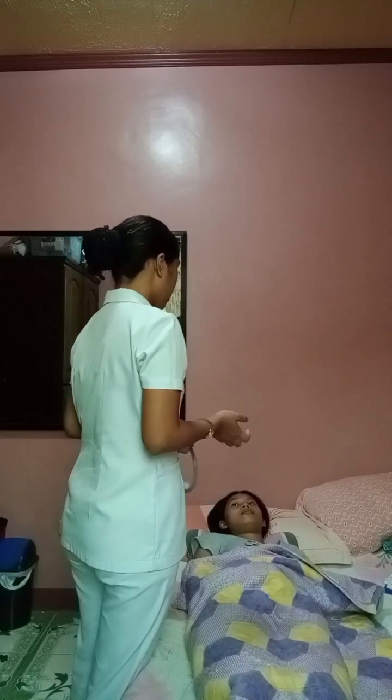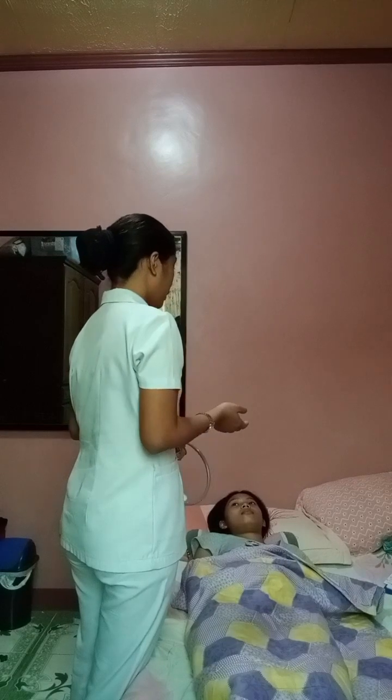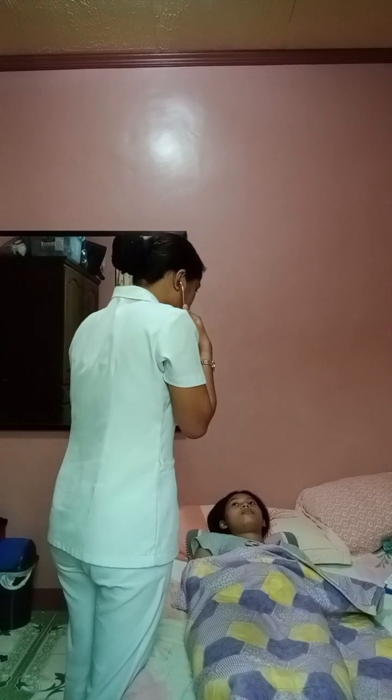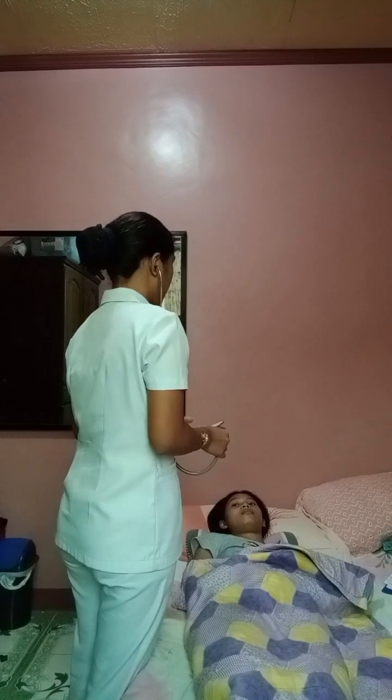So this time I'll be auscultating for the high pitched sound on your aortic, pulmonic, tricuspid, and your apical area. Alright? Okay, so now I'll be using the bell of my stethoscope for low pitched sounds. So I'll be doing the same thing.